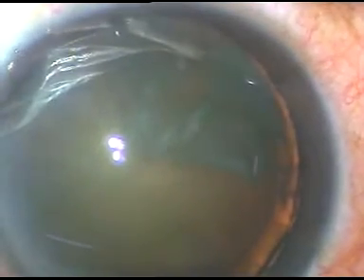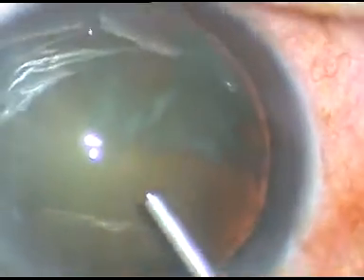Friends, this is phacoemulsification of a cataract with grade 3 nuclear sclerosis. I've started the case. This is the main incision. It is a 2.8 millimeter incision. Now viscoelastic substance HPMC is injected into the anterior chamber.